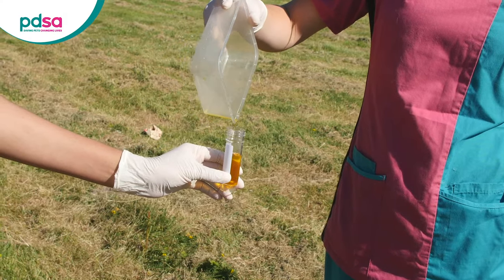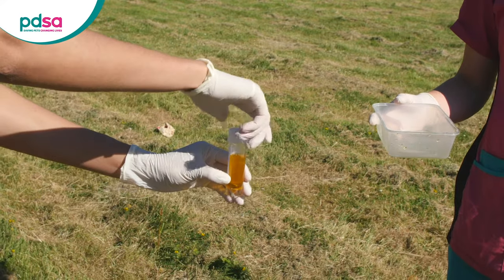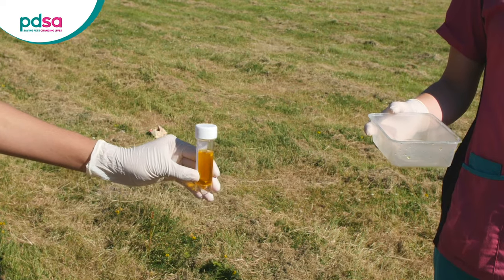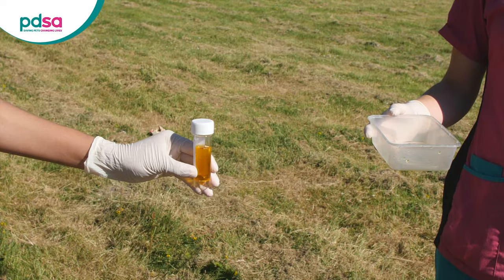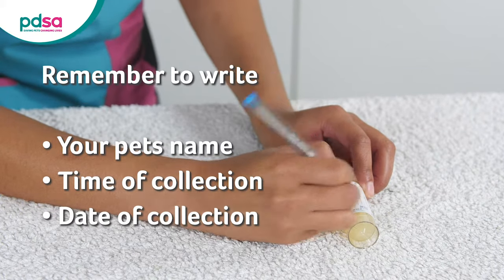Carefully transfer the sample into the pot and securely close the lid. We've collected a good volume here, but don't worry if you only managed to catch a few drops — your vet can run certain tests on a very small amount, so still bring the sample in. Write your pet's name, the time, and date of collection on the sample tube.